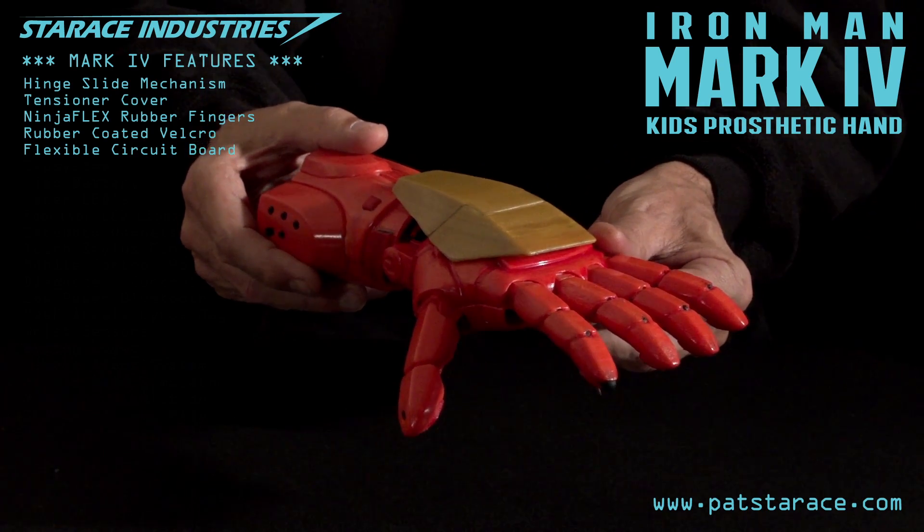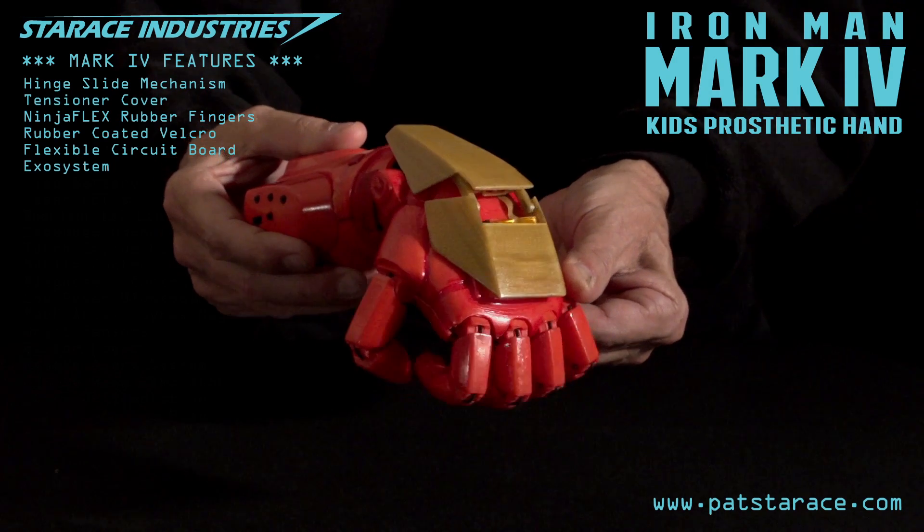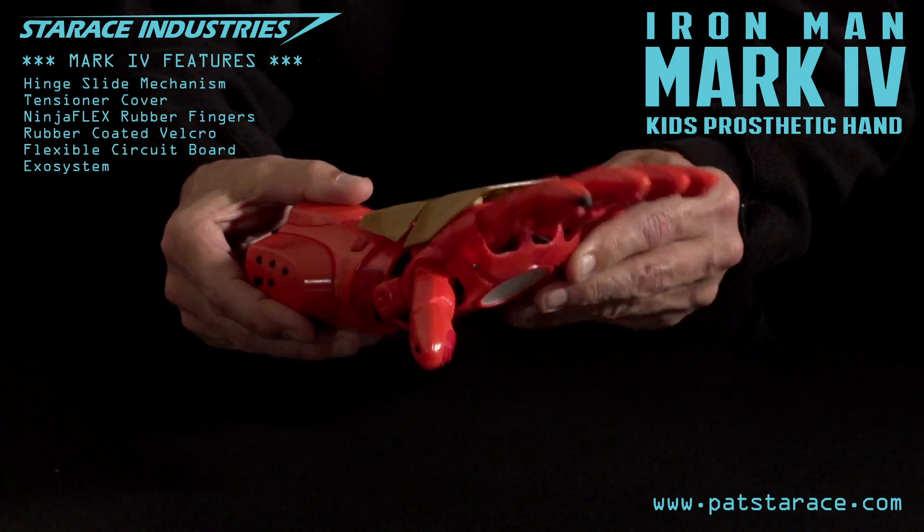Now let's see what this can do. We're online and ready. Exo system test. The armor operates when the hand is bent down — the fingers close. And bent up — the fingers open. Works perfect.